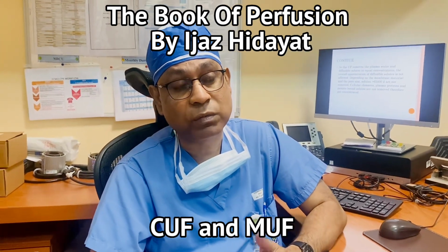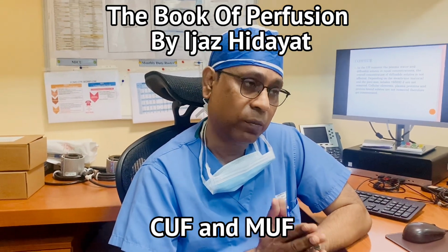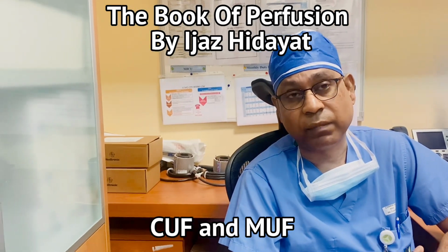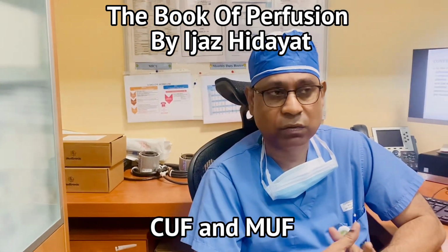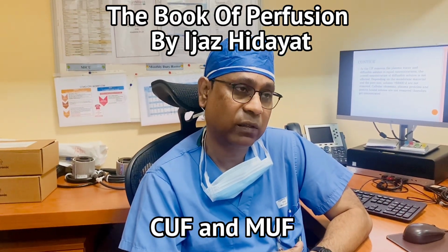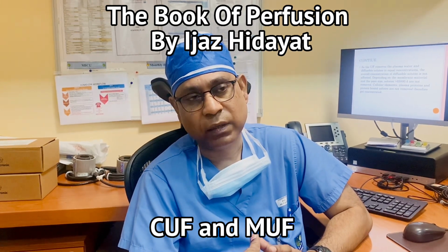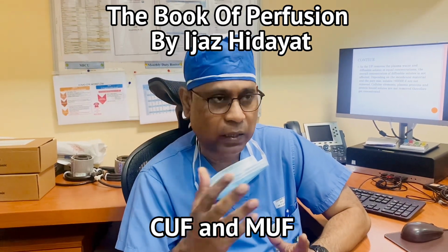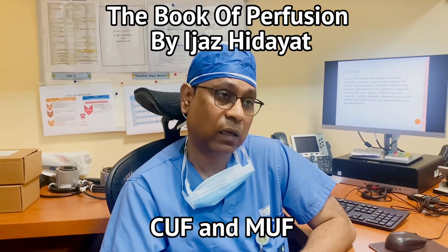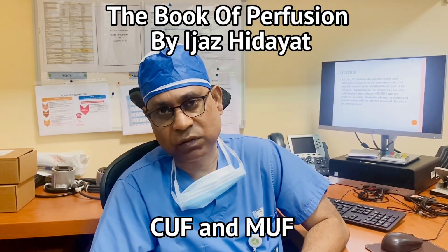And of course, one of the most common benefits of ultrafiltration is that it removes inflammatory markers, which helps improve blood efficiency during the bypass.